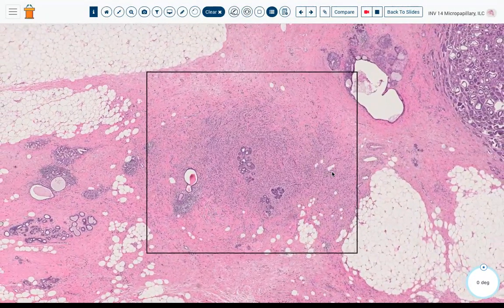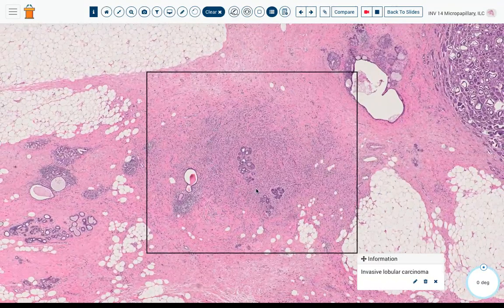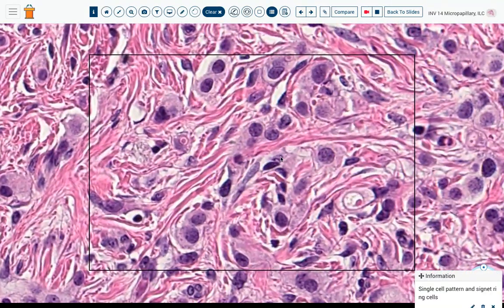If we look at her other cancer, here's her lobular cancer. As before in the previous case, you see the single cells. Here you see a beautiful mucin vacuole with a little red droplet. This is one thing that distinguishes them from the gastric signet ring cells, because they usually have a mucin droplet, but it's filled with many fine vacuoles.